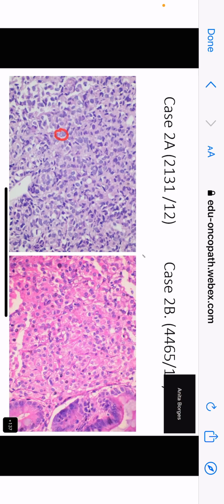Oh, okay. So is that the only one you saw? No, ma'am, many nucleoli are there. All right. Let me ask the other two. Vimi, do you see many nucleoli? No, ma'am. It's actually a stippled kind of chromatin. No prominent nucleoli seen.